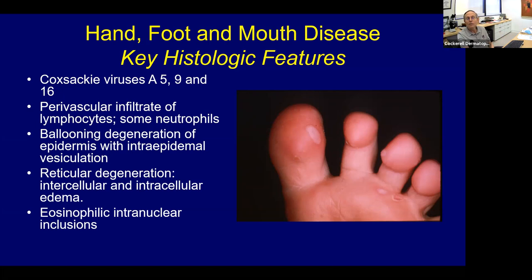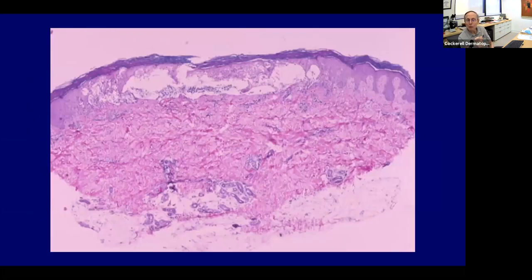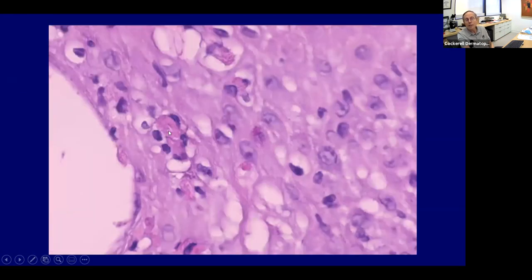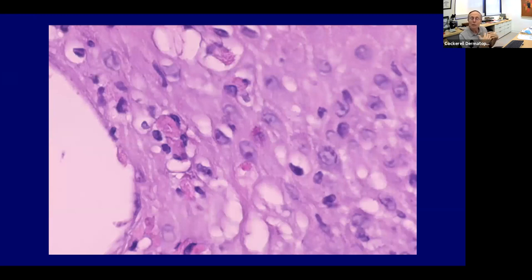In hand, foot, and mouth disease, you see characteristic ballooning degeneration of the epidermis, often on acral skin. These cells all have a ballooned morphology where cells fill with fluid, and you can get pink inclusion bodies — the viral particles inside the keratinocytes. This is similar to but less dramatic than pox virus and parapox virus infections like milker's nodule, with intracellular ballooning degeneration with inclusions in the Coxsackie viruses.